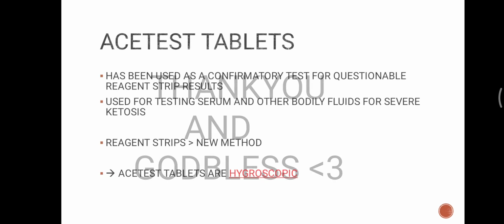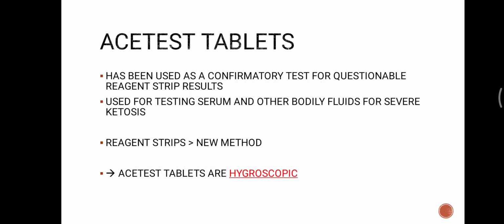So the acetest tablets are hygroscopic. When we say hygroscopic, it means they tend to absorb moisture from the air. So when the specimen is not completely absorbed within 30 seconds, a new tablet should be used.